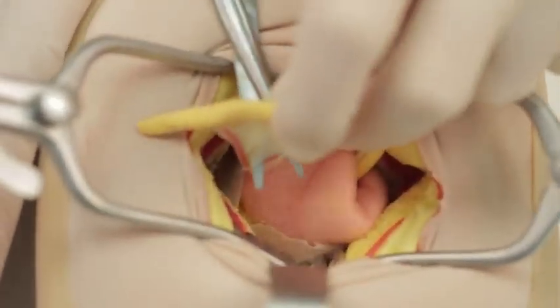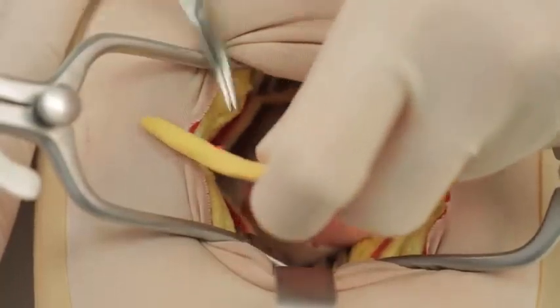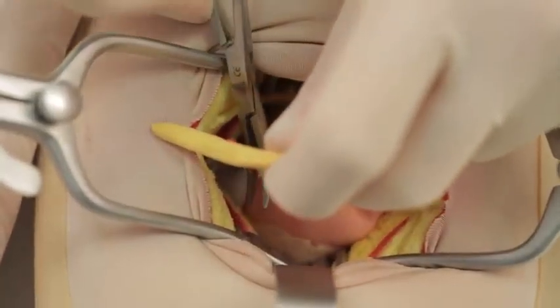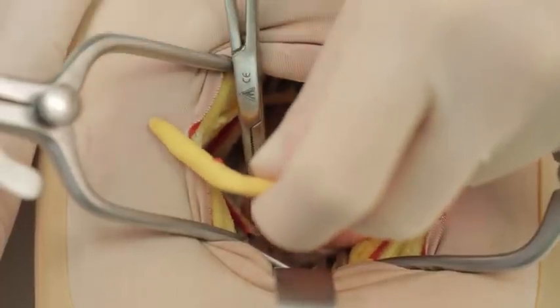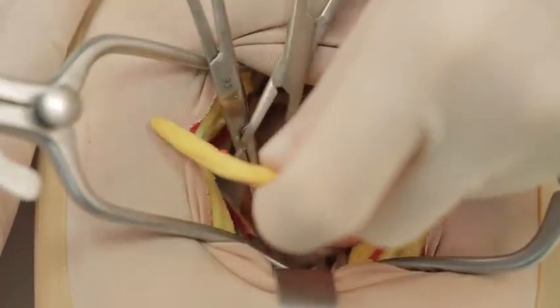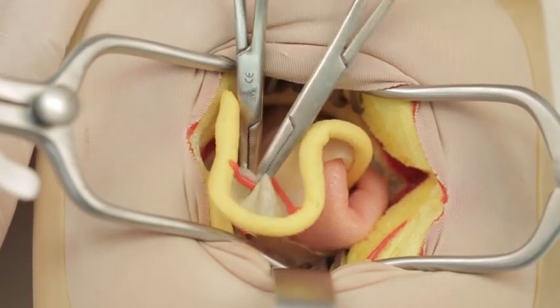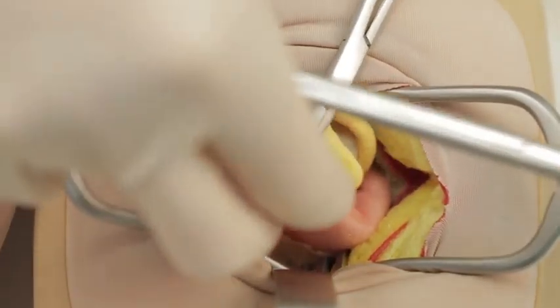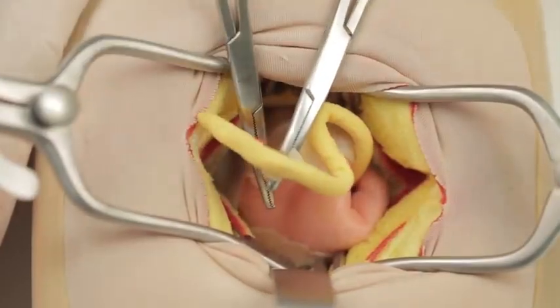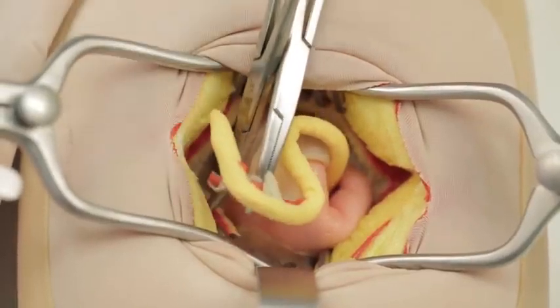Create a window in the mesoappendix, avoiding the vessels, and ligate the vessels between clips using 2-0 Vicryl sutures. Divide the vessels and then divide the mesoappendix.